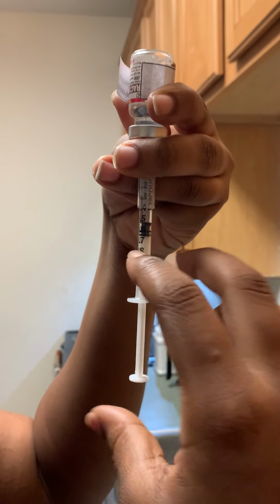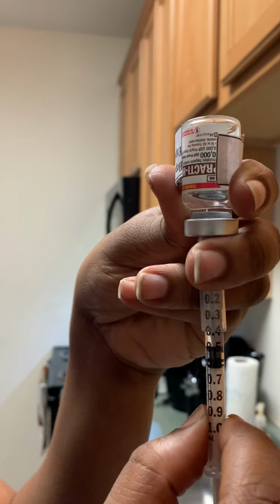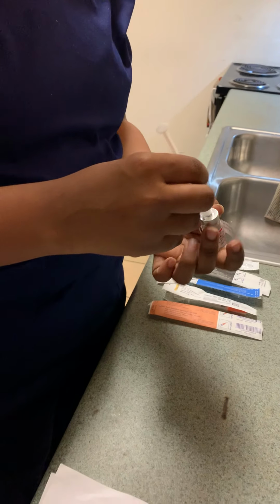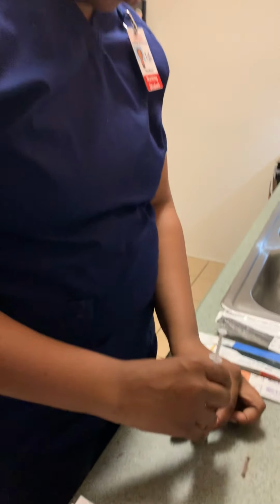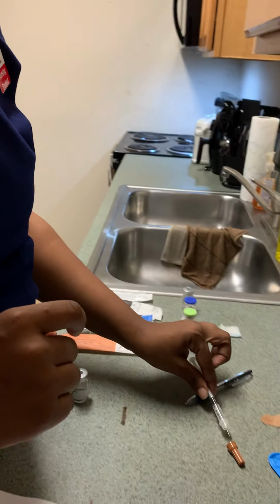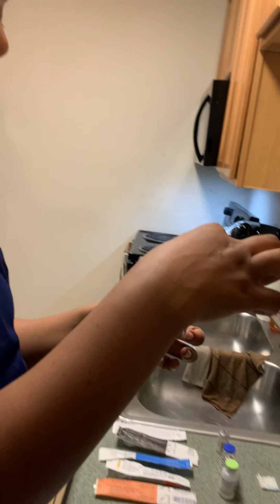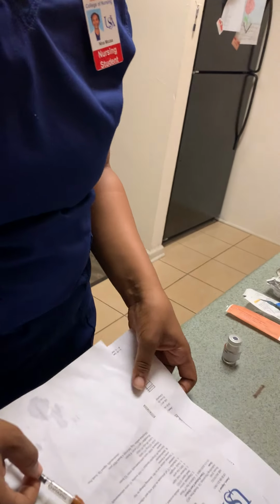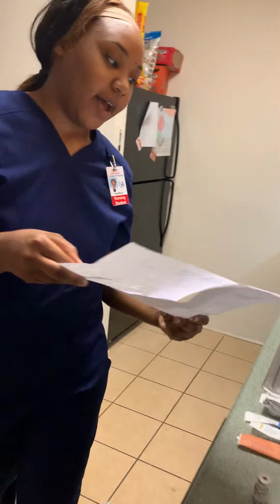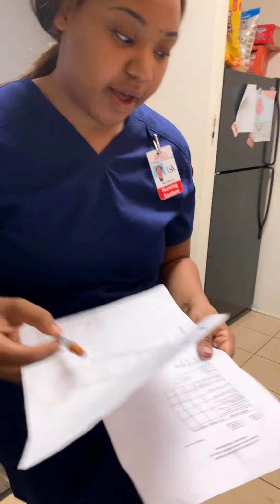I'll get a little more than I need just to be able to expel a little. And 0.5 milliliters of my heparin. Alright, and now I will remove this, and I will place the lid on. Now that I have my heparin, I will take everything and get it checked by another nurse, and she says that everything is okay.